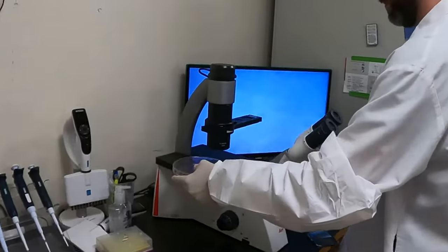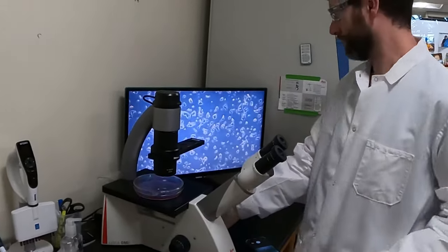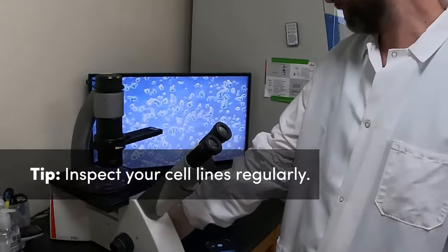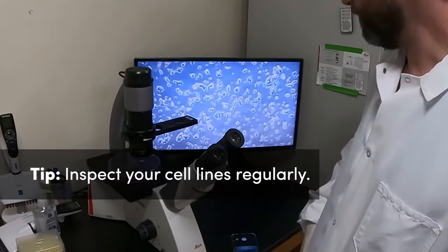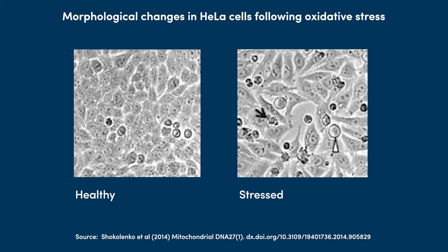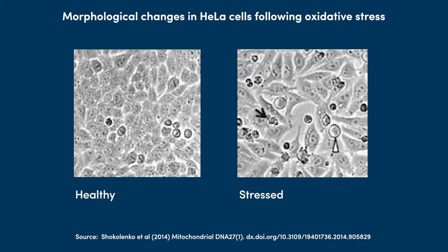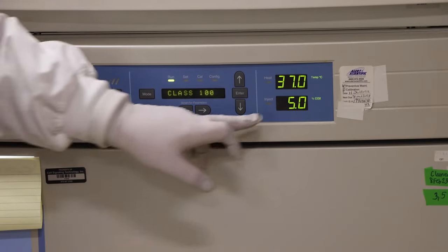This brings us to essential tip number two. Be proactive when it comes to the health of your cell lines. Visually inspect your cultures on a regular basis using a microscope with a phase objective. With experience, you'll learn to distinguish healthy versus stressed cells for different cell lines. How often your cells need to be split can vary depending on the cell line and growth conditions.